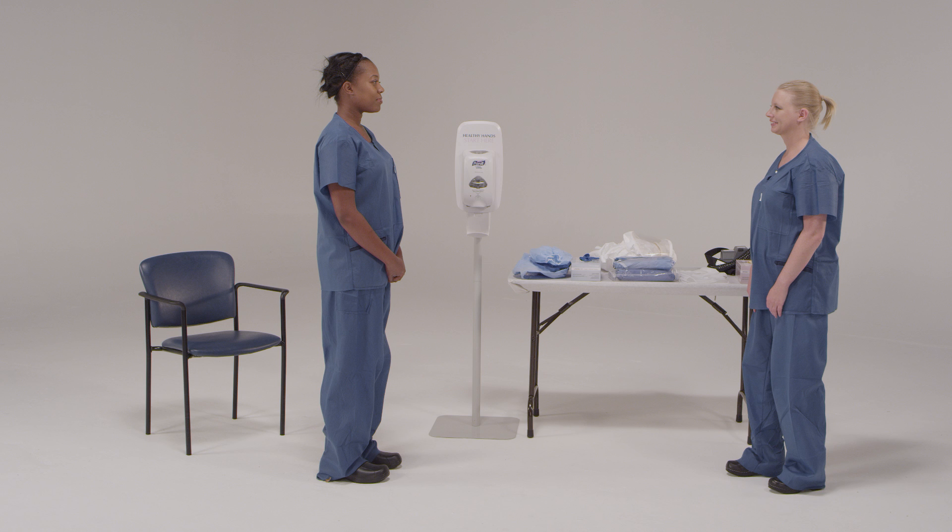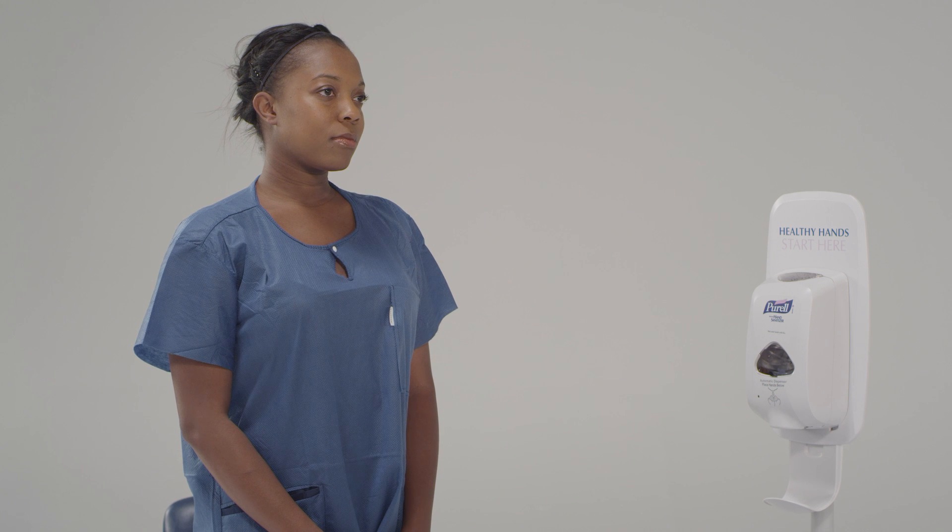No exposed skin or hair should be visible at the conclusion of the donning process. We're now going to work together, carefully, to put on your personal protective equipment. I'm going to be here with you and tell you how to put everything on properly. I am here to keep you safe. We're going to do everything slowly and methodically. If you have any issues or questions, just stop and feel free to ask me whatever you need to. I'm going to give you verbal instructions and you're going to acknowledge them back to me.